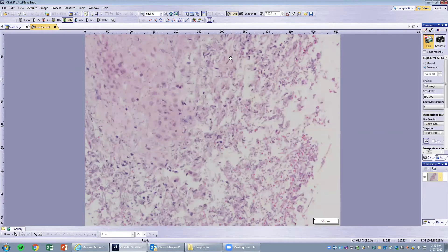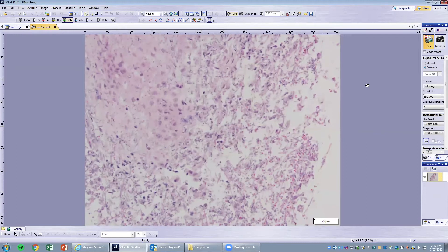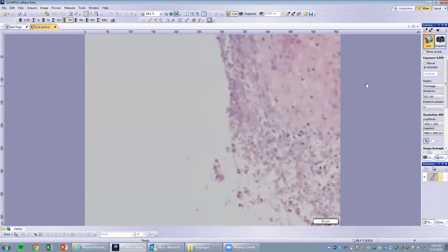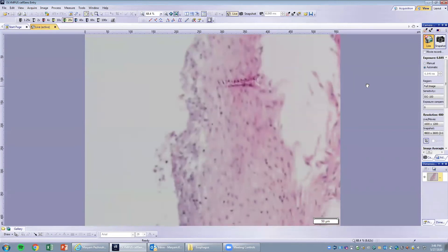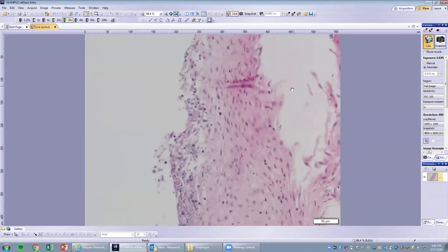A lot of the surface squamous epithelium is sloughed off with mixed inflammation. This is an example of Candida esophagitis. It often presents as white plaques in the mucosa. You can see hyphae going into the epithelium and invading inside — this is a case of Candida esophagitis.